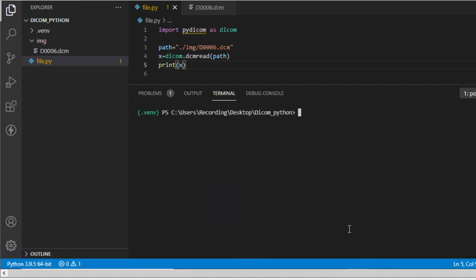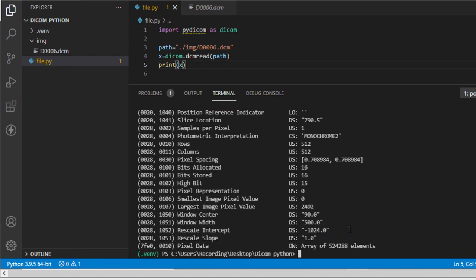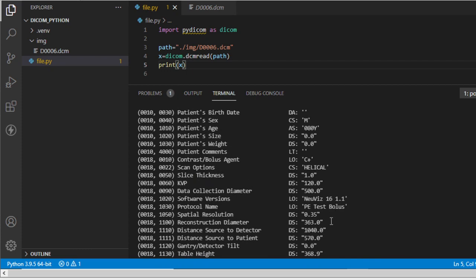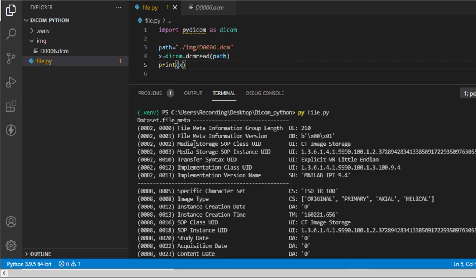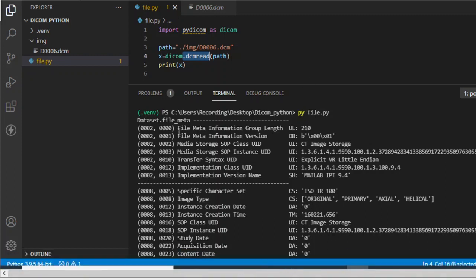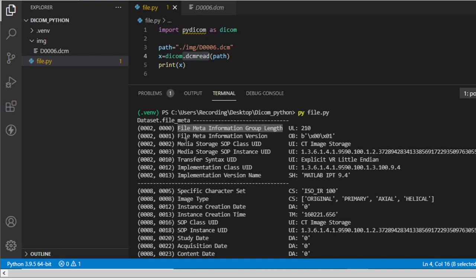If you're using the latest Python, you can call this by typing: py file.py. If you're still using an older version, you can use the old-fashioned way: python and the name of the file. Since I'm using the latest version, I'll use: py file.py, and hit enter. This is how you view the DICOM file using dcmread — notice how the tag attributes are displayed. These are the representation of that particular DICOM file.